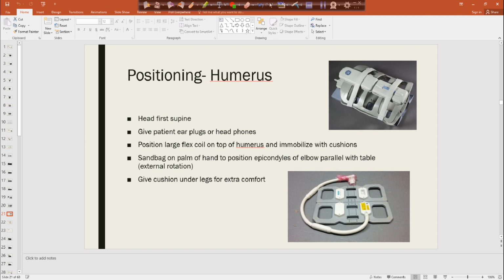What was that? Where we remove half of the phase encoding steps. We go from a square field of view to a rectangle field of view. So any of these long and skinny body parts, we can utilize our rectangle field of view to fill k-space. It reduces time, but we maintain our resolution.